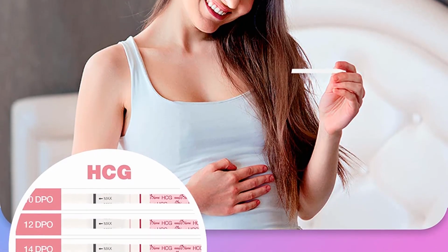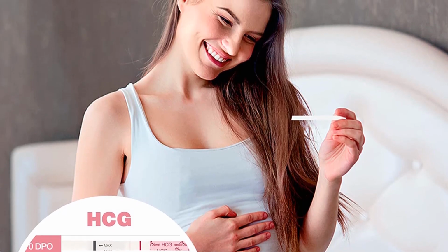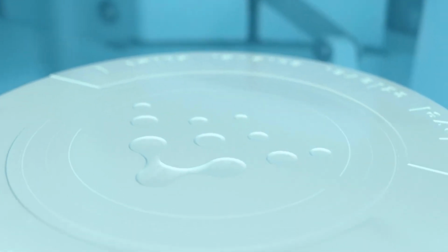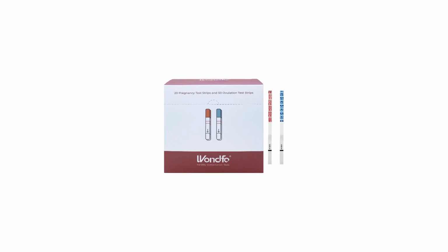A control line will always appear to indicate that the test is working. If the test line appears, there is LH in your system. The darker it is, the higher the concentration. Of course, digital tests can be more user-friendly as they give you a definitive answer that the test is working.